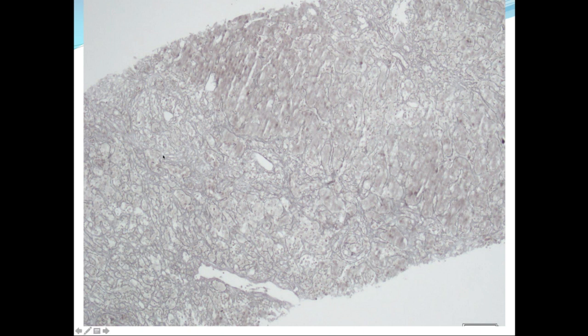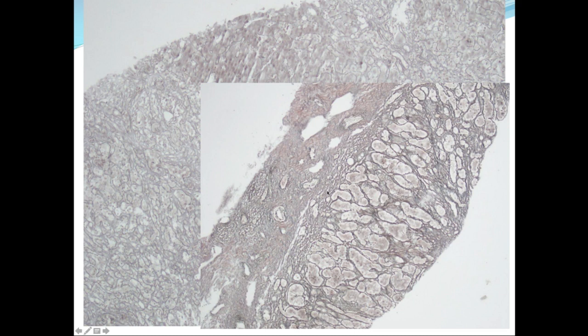And something that's very helpful is the reticulin staining pattern in these necrotic cases. In areas of necrosis, here you can see the collapse of the reticulin framework compared to cirrhosis, where you have this much more dense, closely packed reticulin fibres here.